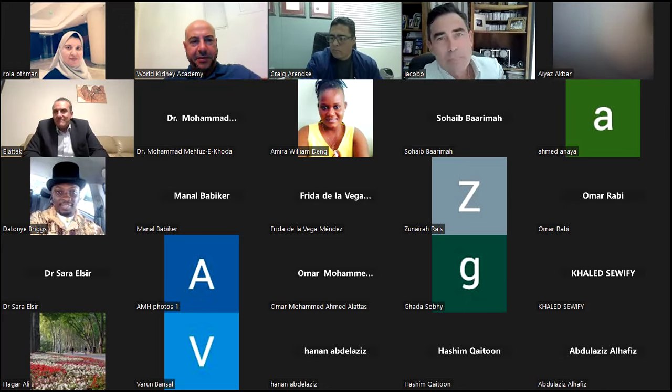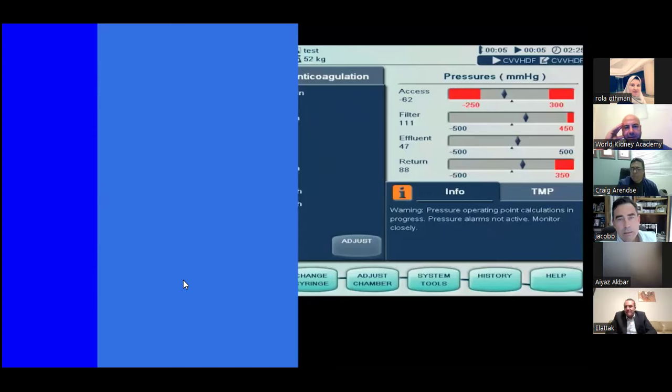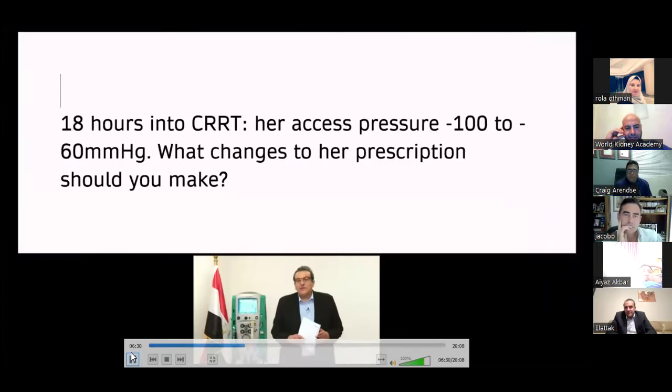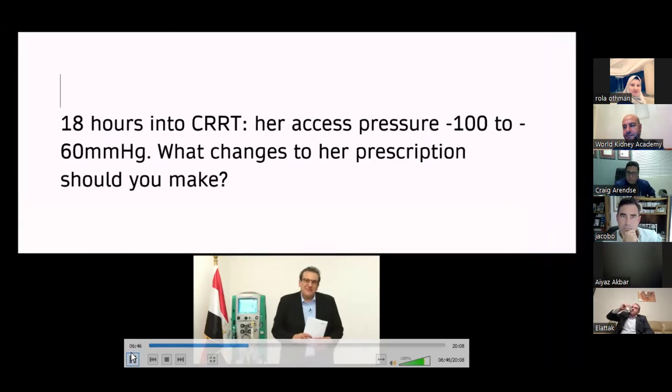Very nice. Let's replay the third part of the workshop and see how it goes. Decision was made to increase the CRRT dose to become 2 liters per hour. 2 liters divided by 50, that means 40 ml per kg per hour. You prescribed 1 liter of dialysate, 0.5 liters in pre, 0.5 liters in post.